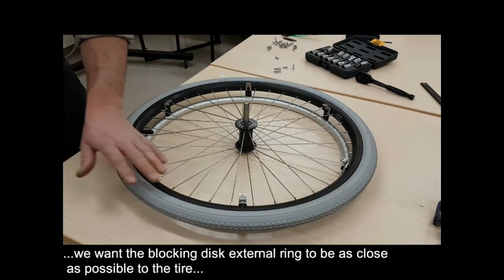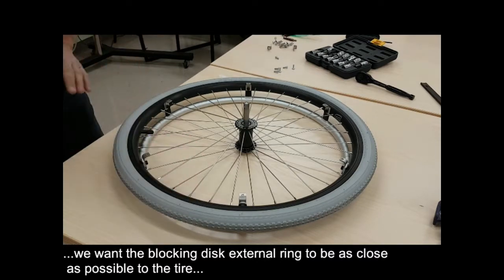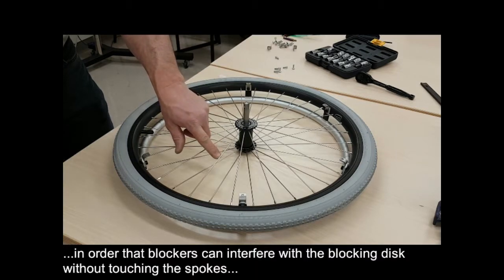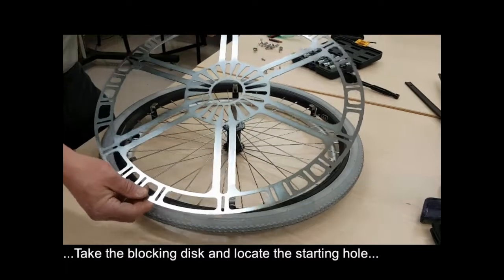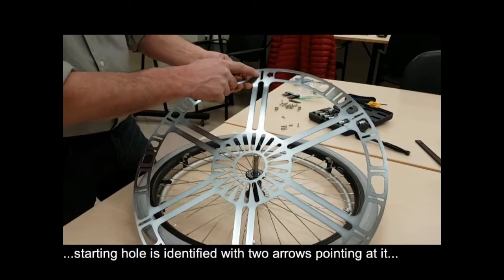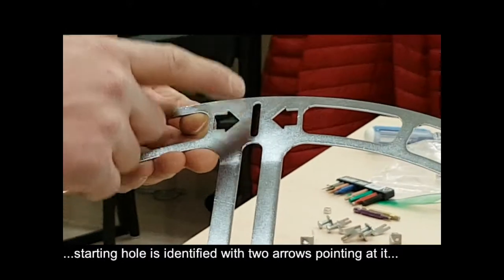What we want is for the blocking disc to be as close as possible to the tire, but we still want to have enough space in the center so that the blockers will go in and won't be interfering with these rods here. So first, we take the blocking disc and identify the starting hole. It's easy to see. Two arrows pointing at it means that you should always start any installation with this hole here.